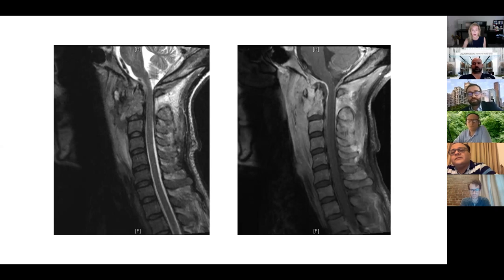Neurologically intact, given the images. So that's obviously funny that you have cord compression, but no cord signal abnormality too. That's what we didn't mention before at the craniocervical junction there. This is interesting because there's no disc abnormality. When we think of infection, we think discitis, osteomyelitis. You don't have any disc abnormality here, so it's not discitis, but you do have probably that synovial enhancement. You said it's infection, so it's got to be infection. We could have also said maybe inflammatory, but probably not that much prevertebral enhancement if it was inflammatory or anything else. Mm-hmm. And we can see definitely the ADI here is increased if you look closely.